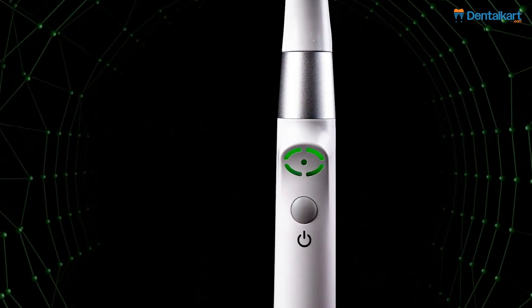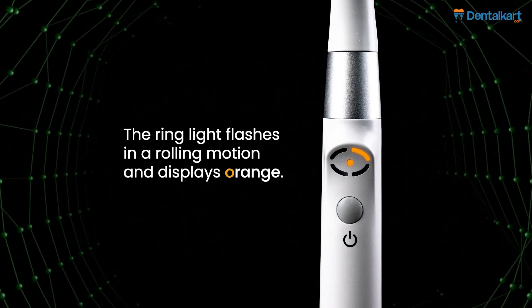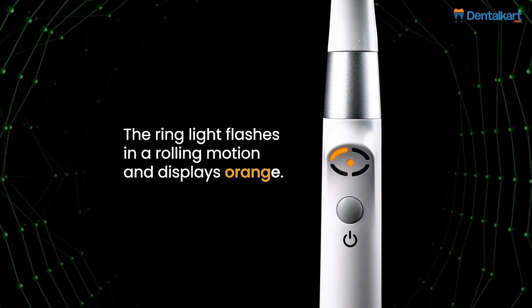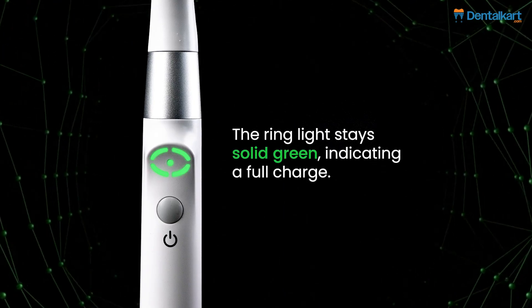Let's understand the power status. The ring light flashes red continuously, indicating low power. Light flashes in a rolling motion and displays orange when charging. Light stays solid green, indicating a full charge.